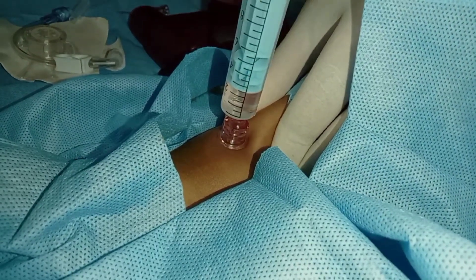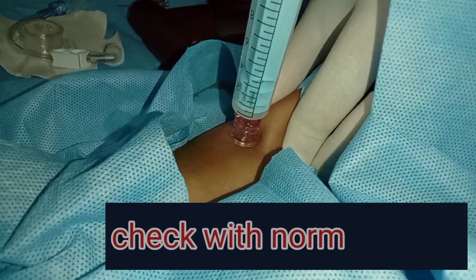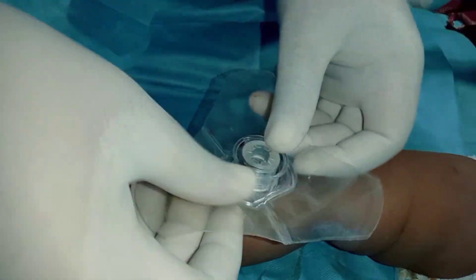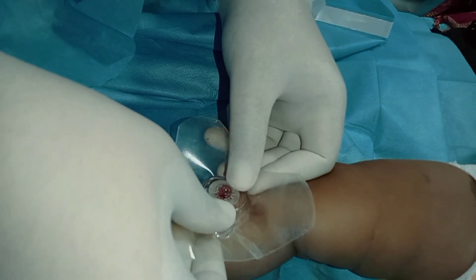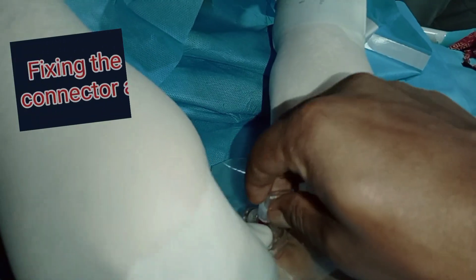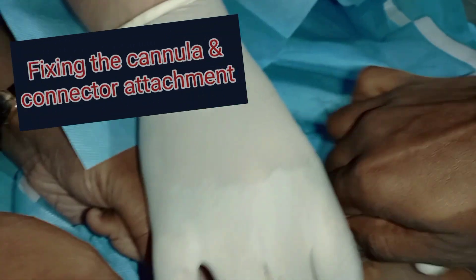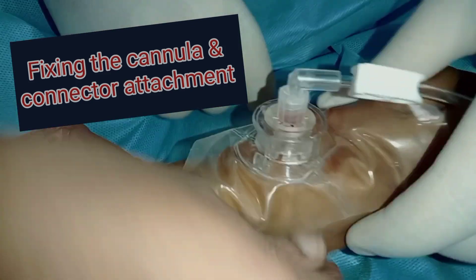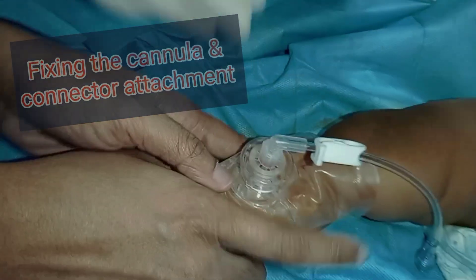Now it is time to push a saline fluid bolus through the needle to check for patency. Once patency is confirmed, the needle is fixed with a tape and the connector is attached, through which fluid or medication can now be given.